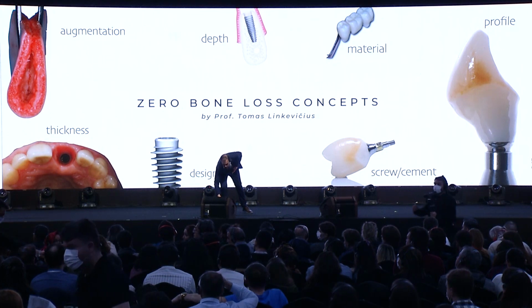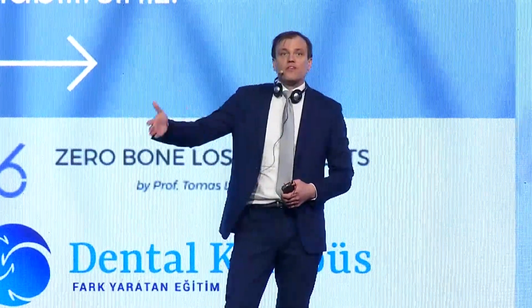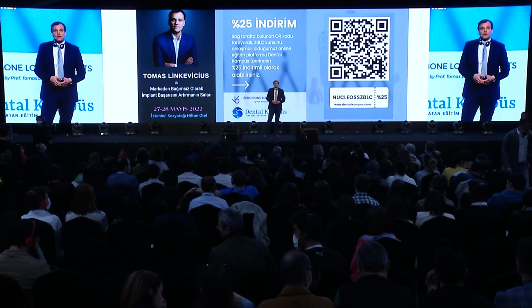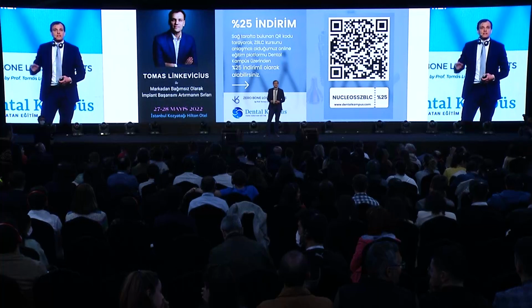How can we polish zirconia? Which instruments? It's not possible to explain it now because it's really a process. We used Ceraglaze instruments and the final step was polishing paste, but there is a sequence: you start from the rougher, fine, superfine, and polishing paste at the end.